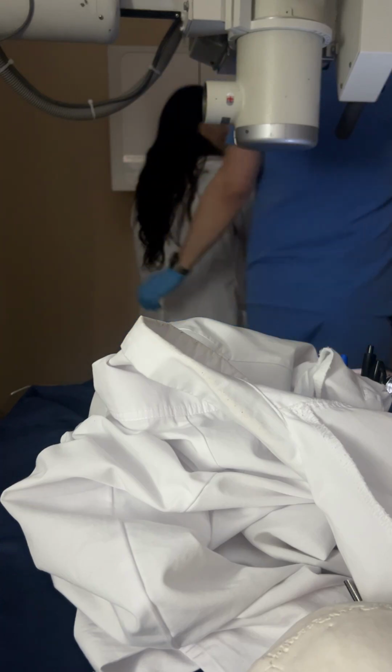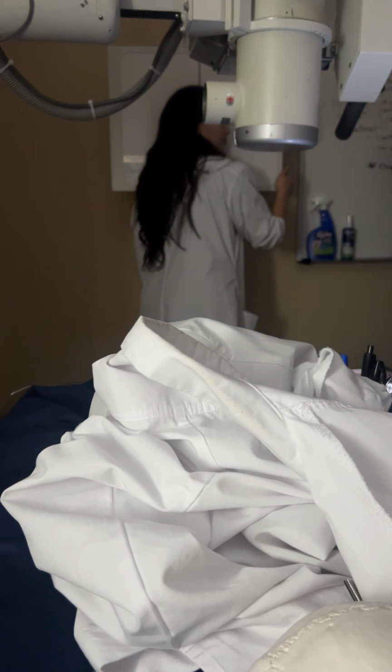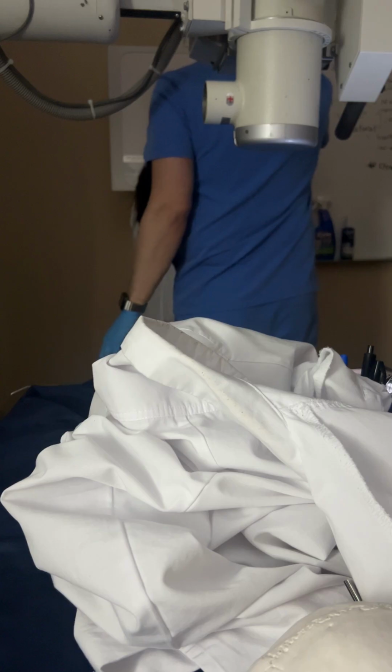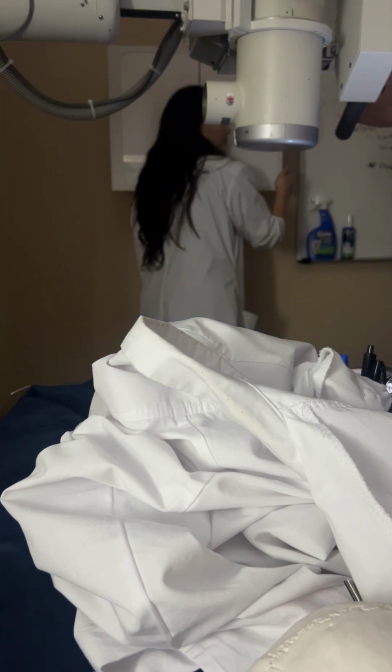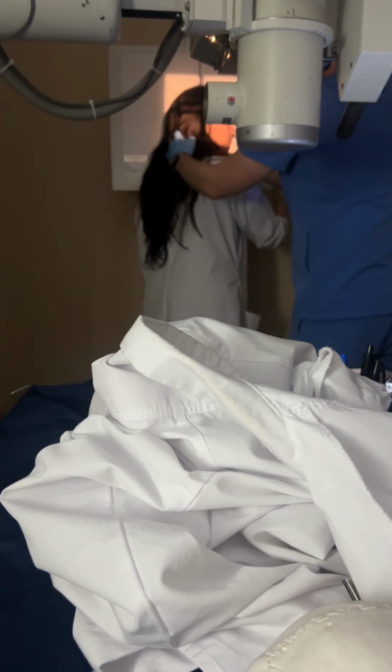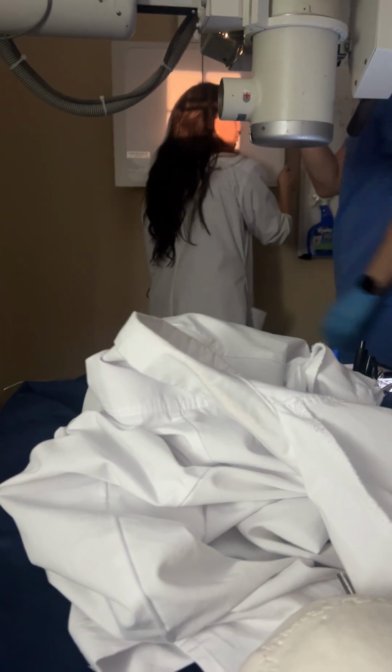Okay? So that's good. Second thing, very important for a lateral, we're going to come to the front and make sure that there's no tilt on her skull. Okay? Because everything has to line up perfectly lateral. So she looks like she's good. She doesn't look like she's rotated really in either direction. Great. Where's my CR? There it is. We're going to come forward just a hair. Great.